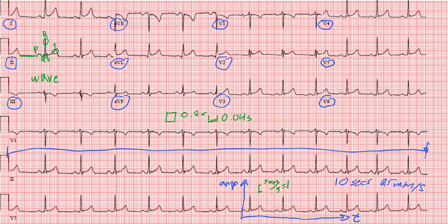Waves together create what's called a complex — a combination of waves. The most obvious complex we talk about is the QRS complex, which is this group of waves. This specific group of waves is known as the QRS complex.